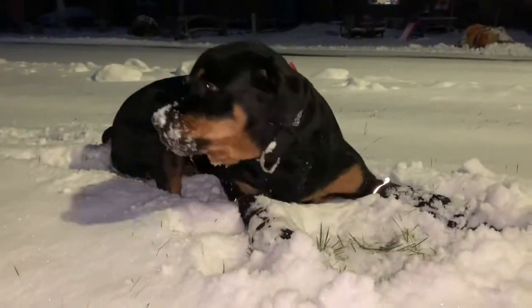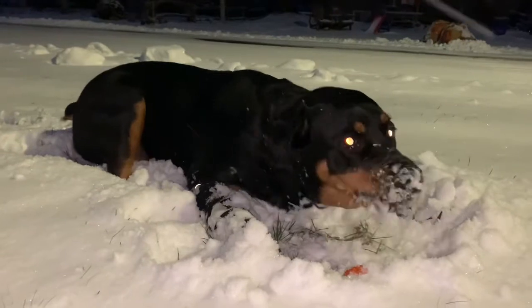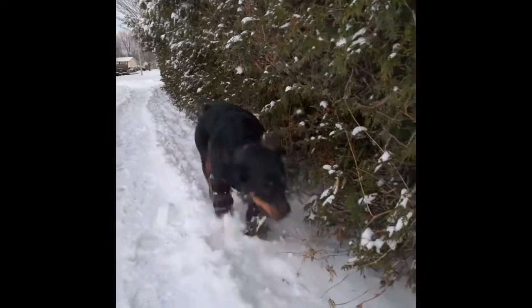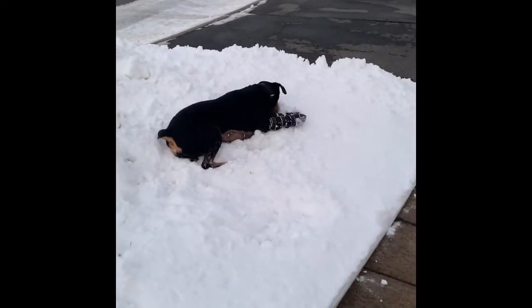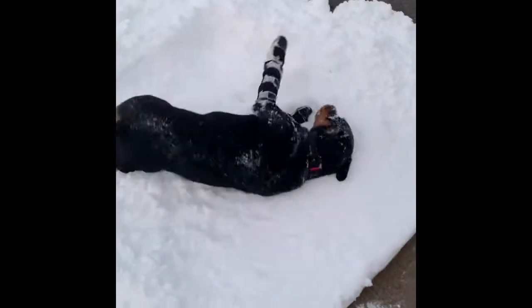Then the snow flew, and so did her progress. Because she has to work twice as hard to walk compared to other dogs, the colder weather really allowed her to push herself without overheating. Plus, she loves the snow. After searching everywhere for a solution, we were fortunate enough to have a recommendation from our favorite pet store manager for winter boots appropriate for Lily. They're made for deep snow, so they fit over her prostheses and keep her dry and warm. 2 very important things for partial amputees. And most importantly, lets her have the best time.